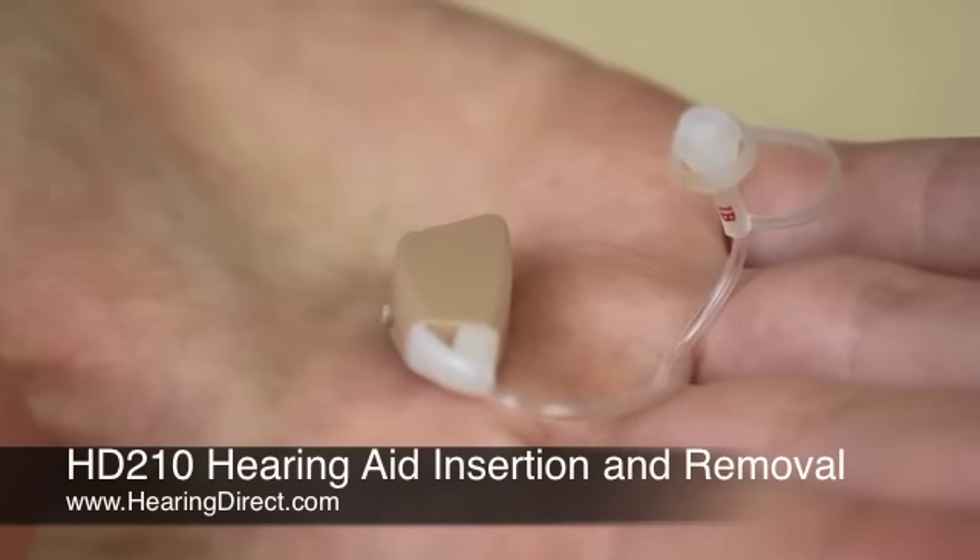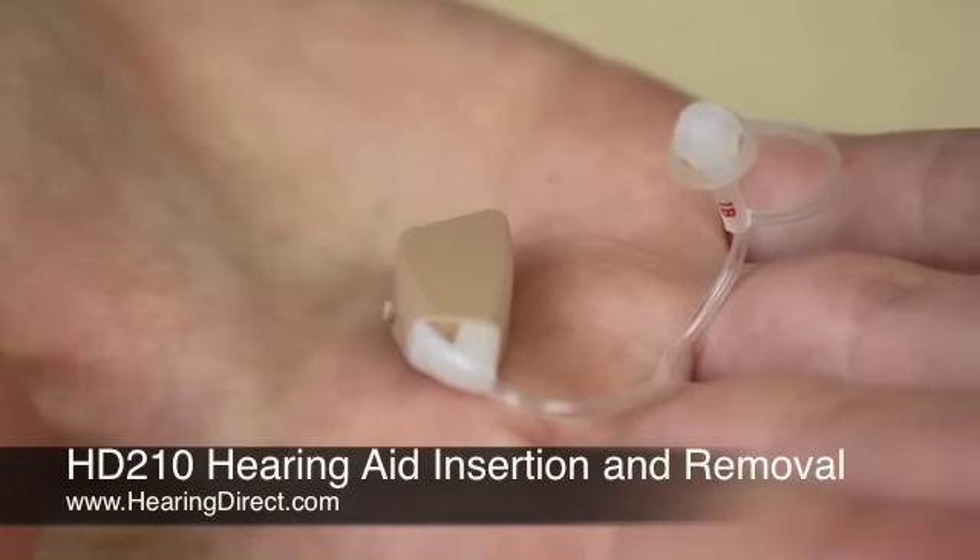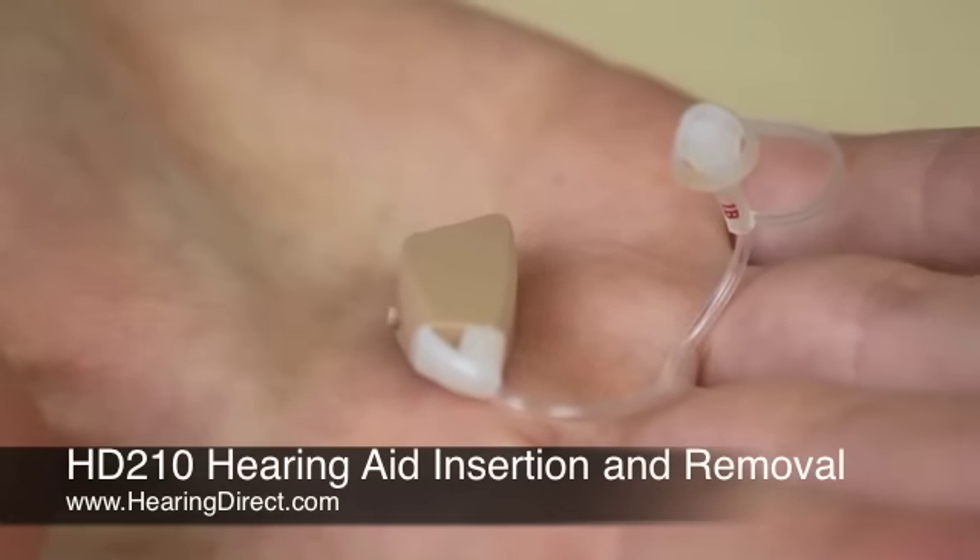The tubings can either be for the left or right ears. Left is indicated by blue writing at the bottom of the tubing. Right tubing is indicated by red writing.